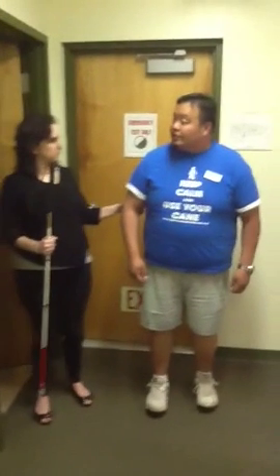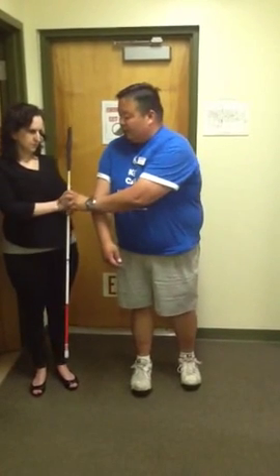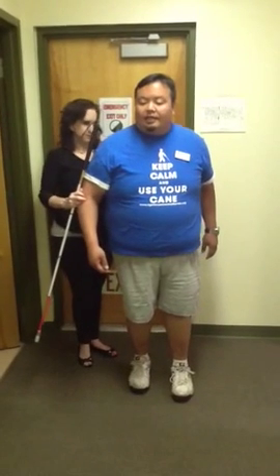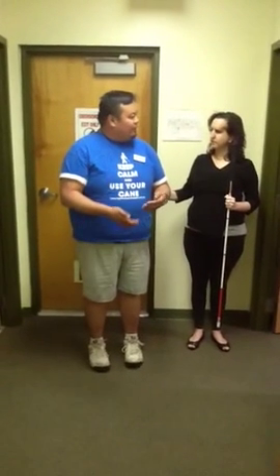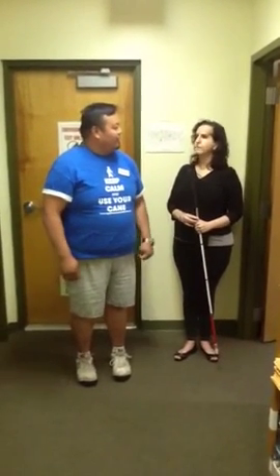Now if we're going to switch sides, you're going to take your hand and place it on my elbow, right here. You're going to follow your other hand to the back. Then you're going to switch hands with your cane, move it back. There it is, right there. So just like all the other techniques that we've used with the about face, the switching sides, and the human guide, it's the same technique. It's just now you have a cane in your hand.